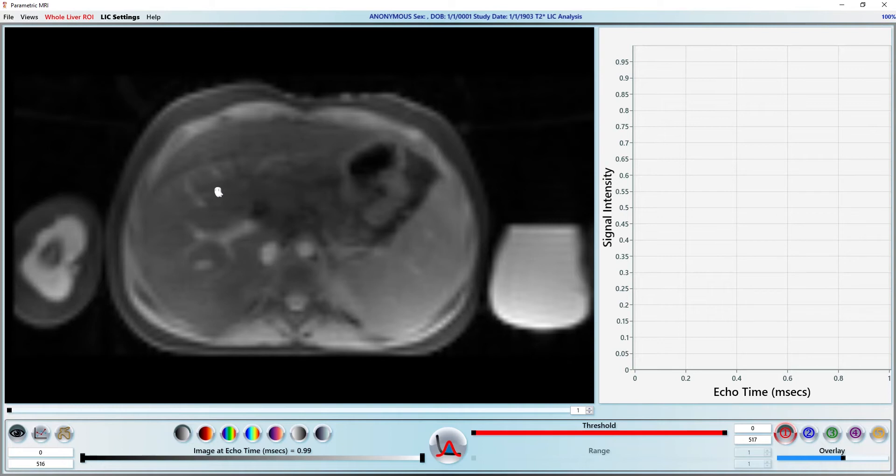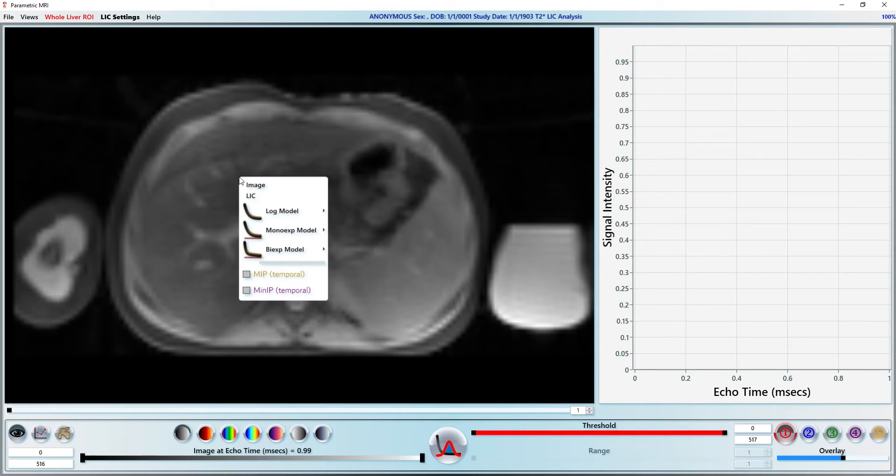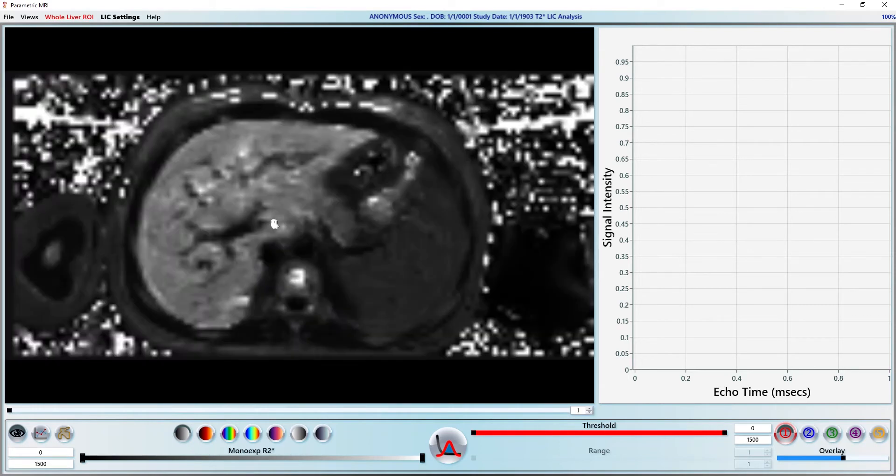We do this by placing a region of interest inside the liver. The software will do the rest. My preferred way to do this for this type of data is to use an R2 star map. We right click on the image and select the mono-exponential R2 star map from the options. This is sometimes referred to as the offset model in the literature.